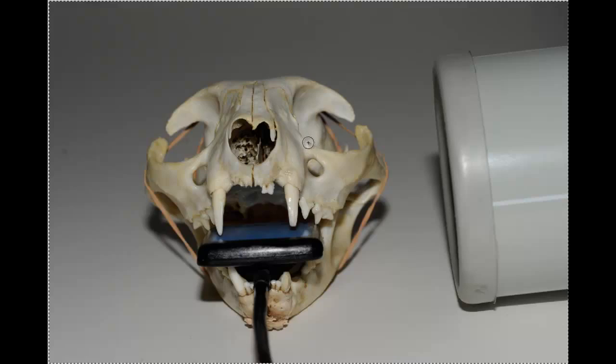In this particular instance, the approximate angles of these teeth is pretty close to vertical. That is primarily because we have the cat in what would be referred to as sternal recumbency here. The angles still apply whether the live animal is lying on the right side or the left side. So here we have roughly a 90 degree angle between the sensor, which in this case is pretty much horizontal, and the side teeth, which are pretty much vertical, which leaves us a bisecting angle of about halfway.